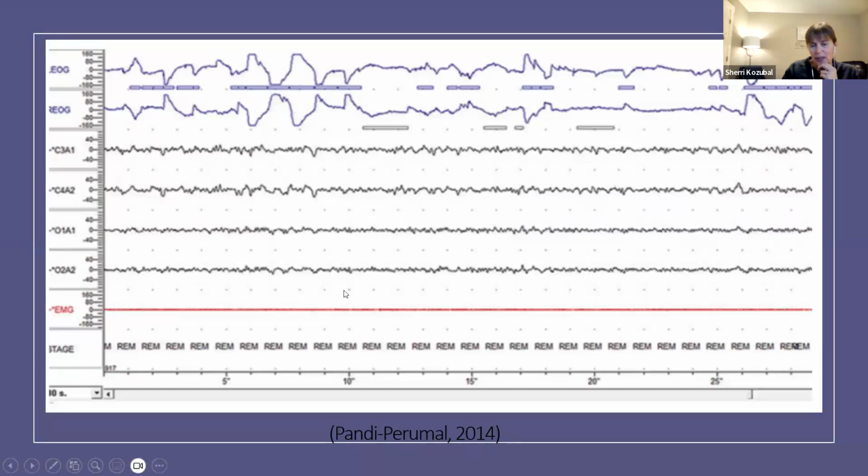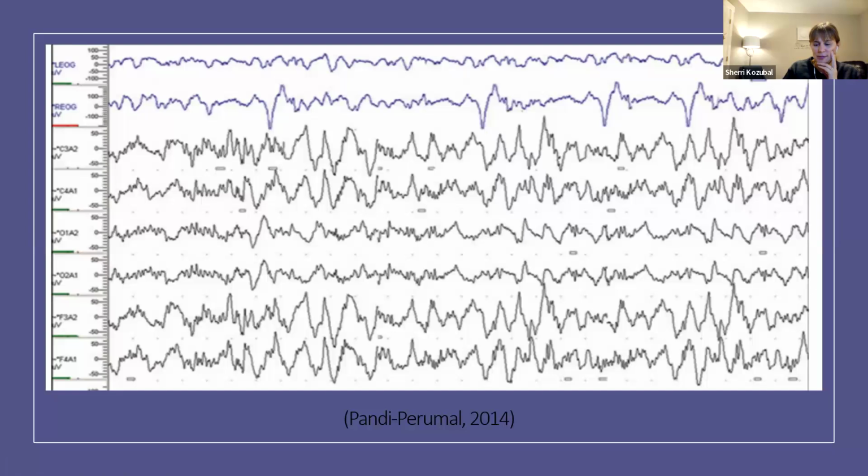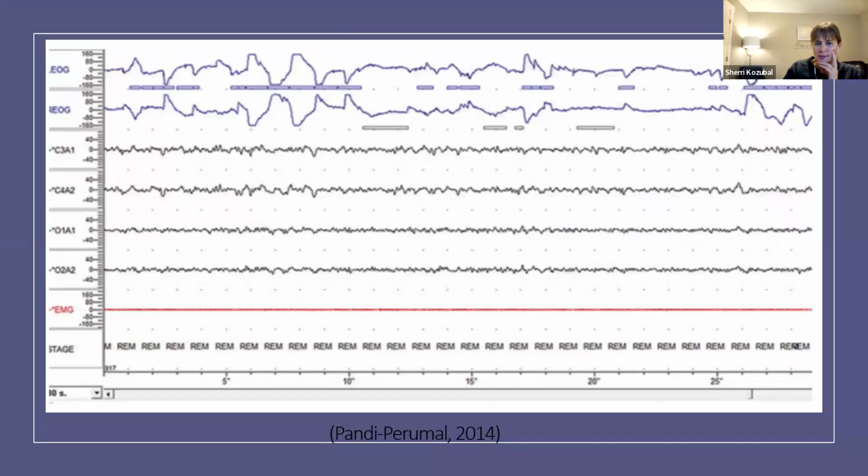This is REM. So you can see how quiet. All of a sudden we can go from this to this. And that's literally how it happens. And the eyes, everything gets quiet, and then the eyes start with this beautiful open, close, eyelids not open and closed, but the eyelids moving underneath, up and down and side to side. And that's how they make these beautiful patterns.